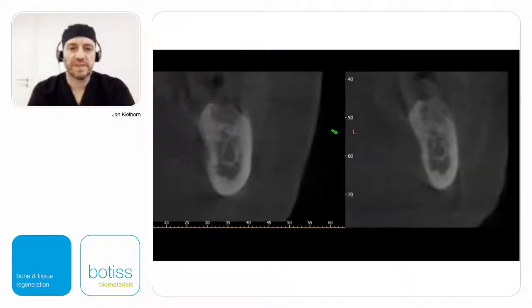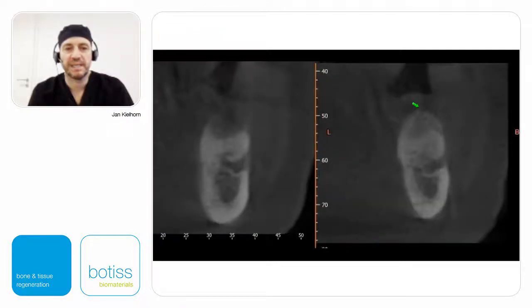So, going to the next slide, we see that this has been the augmentation we performed. You see there was a defect, and you got some augmentation in height, which you see even here, how much augmentation you gained within structure. So you really got a nice augmentation in vertical height in a very safe maneuver.